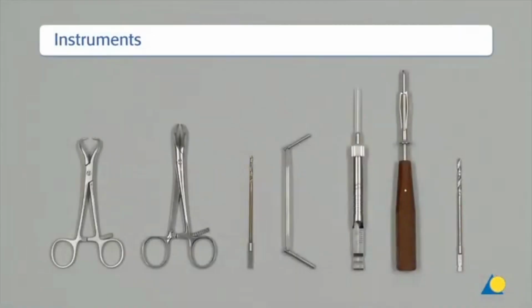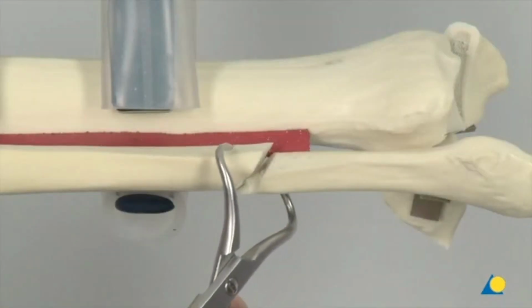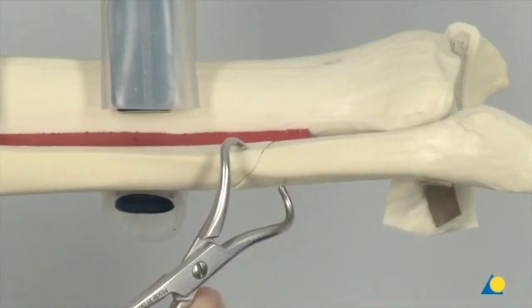The required instruments for fibular reduction and fixation are the pointed reduction forceps, the toothed reduction forceps, the 2.5 mm drill bit, the 3.5 mm universal drill guide, the depth gauge, the hexagonal screwdriver with holding sleeve, and the 3.5 mm drill bit. Clinically, the pointed reduction forceps would be used to reduce the initial fracture displacement.